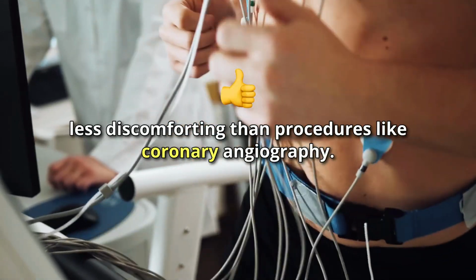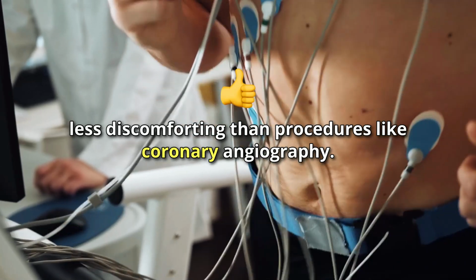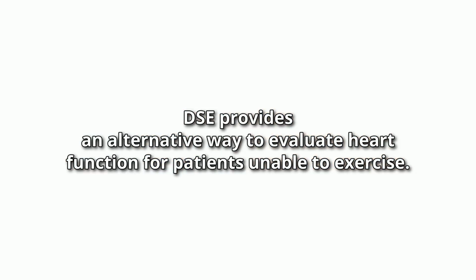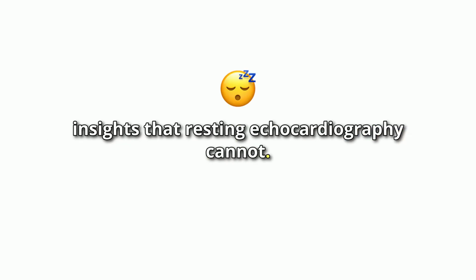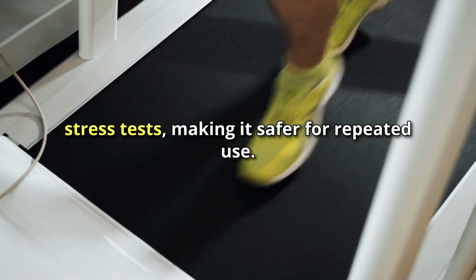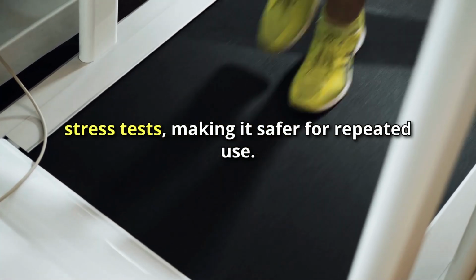DSE offers several advantages. It's non-invasive, making it safer and less discomforting than procedures like coronary angiography. For patients unable to exercise, DSE provides an alternative way to evaluate heart function. The test also allows for dynamic assessment under stress, providing insights that resting echocardiography cannot. Additionally, DSE does not involve radiation, unlike nuclear stress tests, making it safer for repeated use.